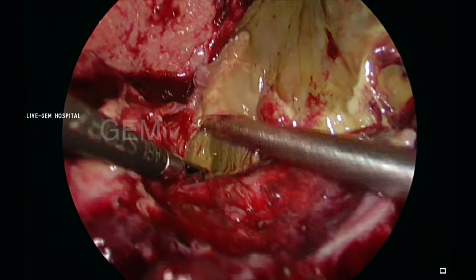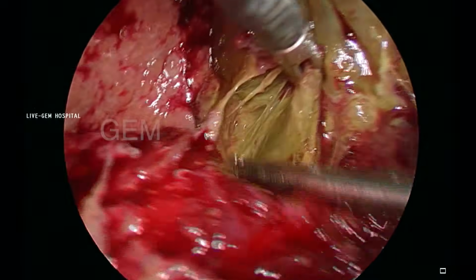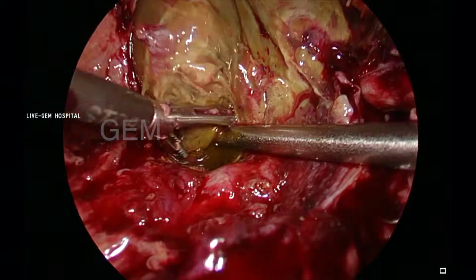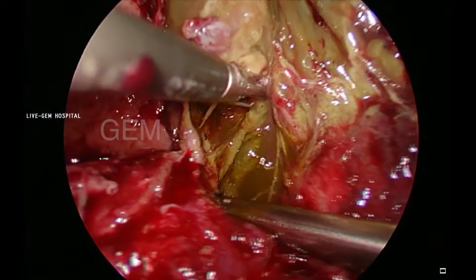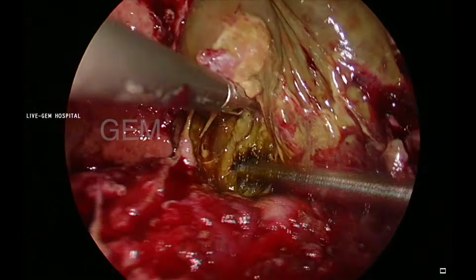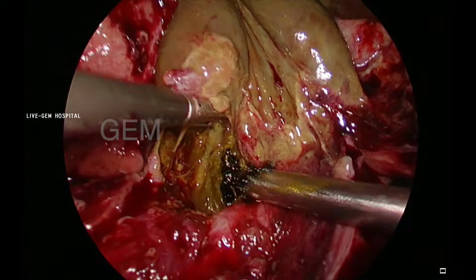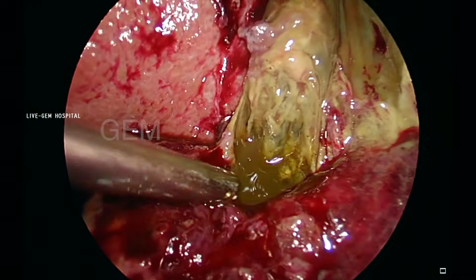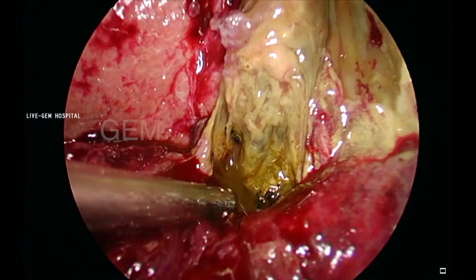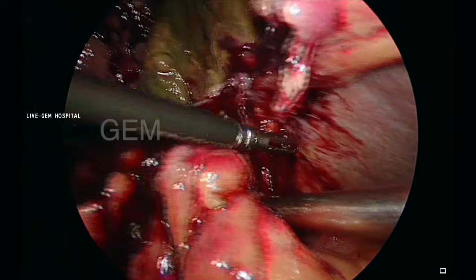So I am trying to separate the gallbladder from the omentum or the duodenum. You can see only the mucosa is being separated. The anterior wall of the gallbladder I left on the duodenum. The gallbladder got open, and you can see a lot of small black pigmented stones. If these stones spill, they are very difficult to take out. So you have to take them immediately.